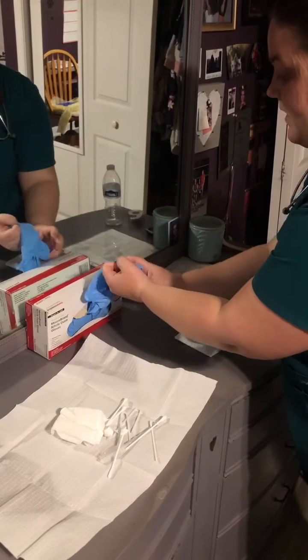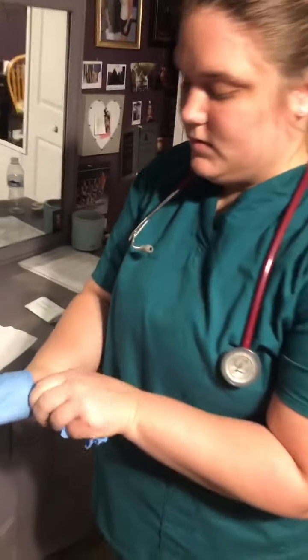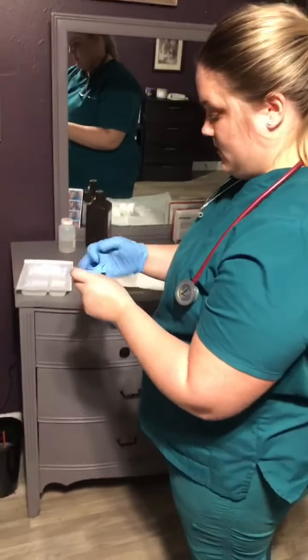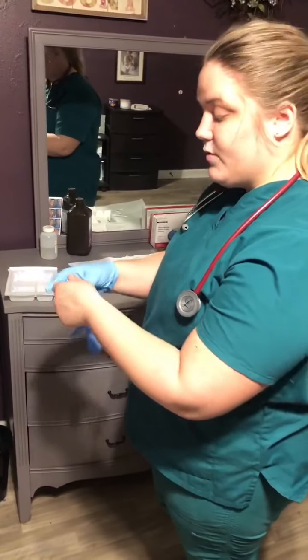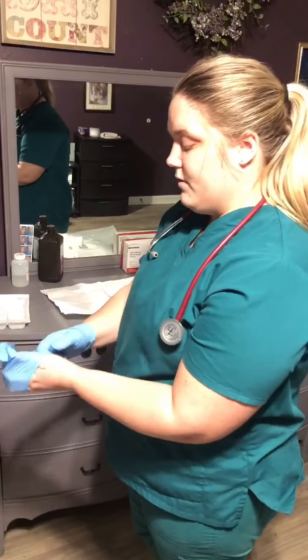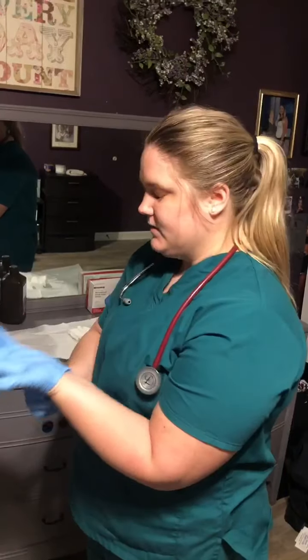So at this point, I've been back into the room, knocked on the door, washed my hands, and I identified my patient again. I reassessed their pain level, and I'm starting the procedure. So get my clean gloves on. So I verified all 3 things on their armband: the medical record number, the birth date, and the name of the patient, and reassessed their pain scale.